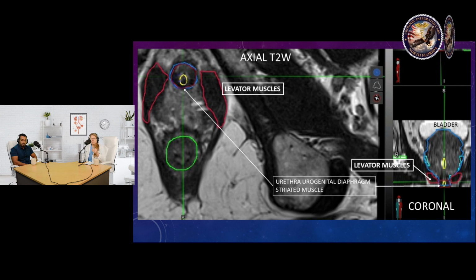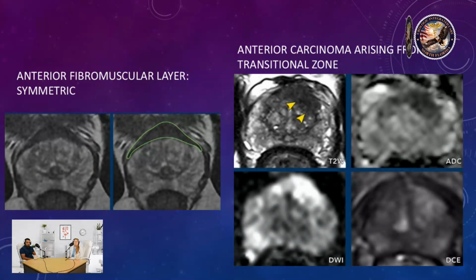I found personally that in patients that have tumors that impinge into the apex close to the sphincter, we've been able to successfully ablate about a quarter of the area close to the sphincter without causing any type of incontinence in our patients. But it is very important to know the anatomy and to outline it on your MRI while you're doing ablations in the apical region. Okay, next slide.